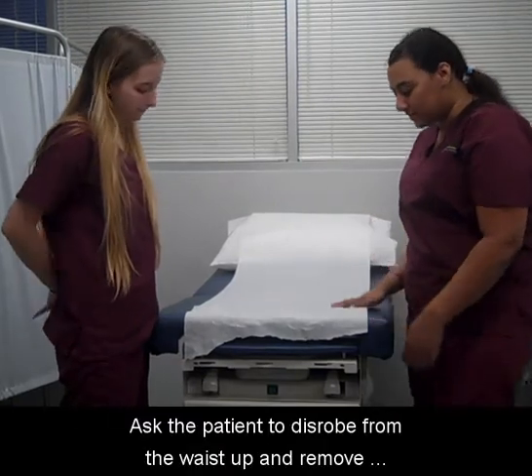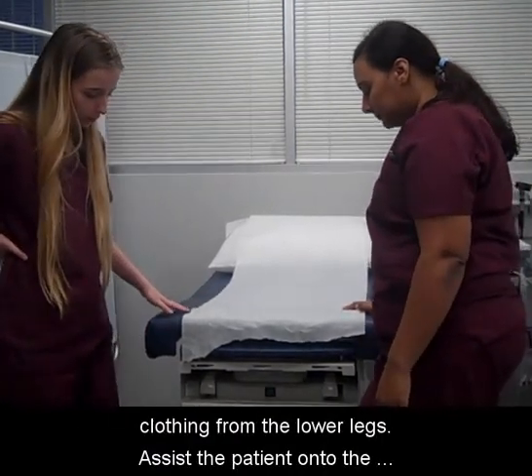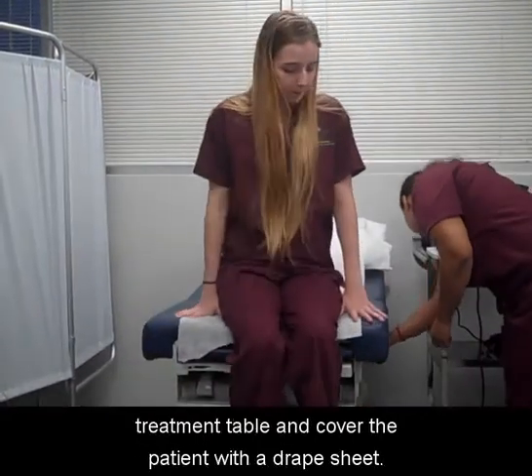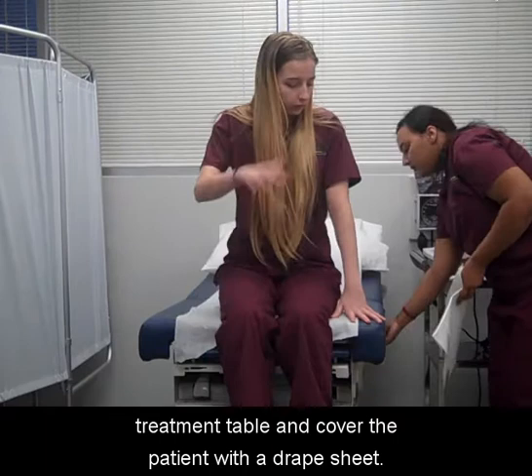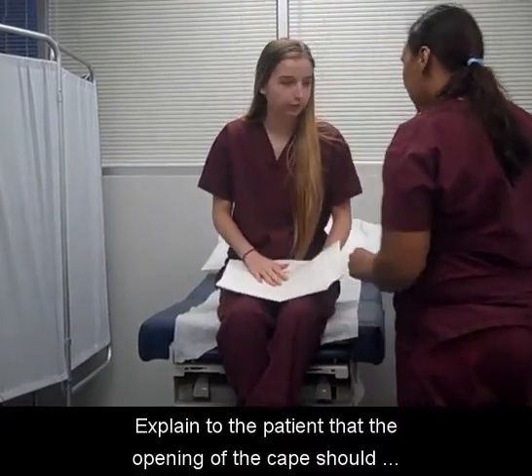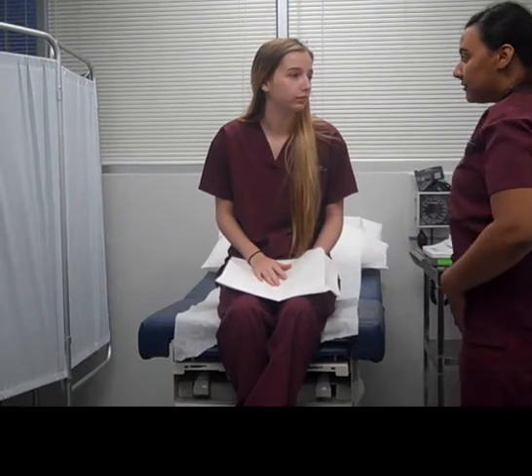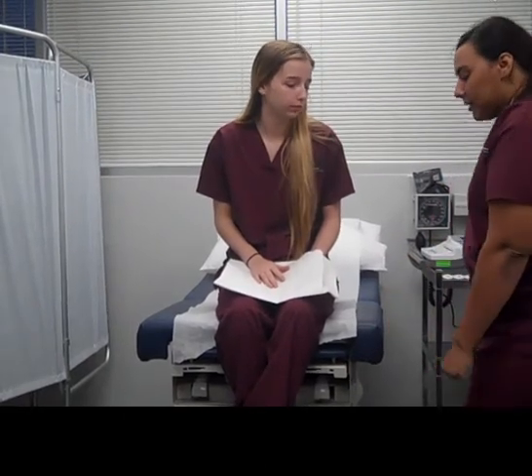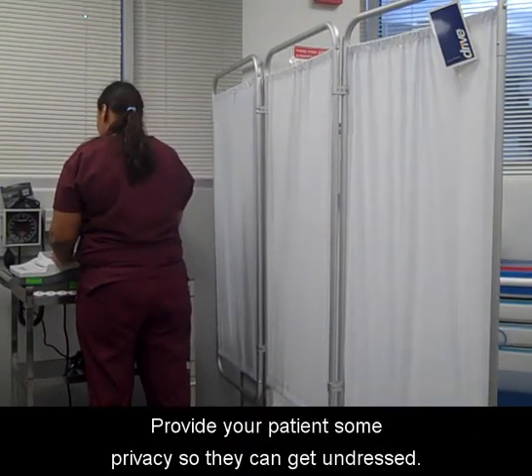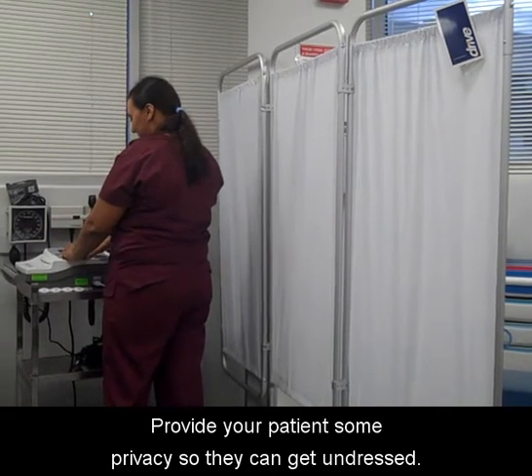Ask the patient to disrobe from the waist up and remove clothing from the lower legs. Assist the patient onto the treatment table and cover the patient with a drape sheet. Explain to the patient that the opening of the cape should be in the front. Provide your patient some privacy so they can get undressed.